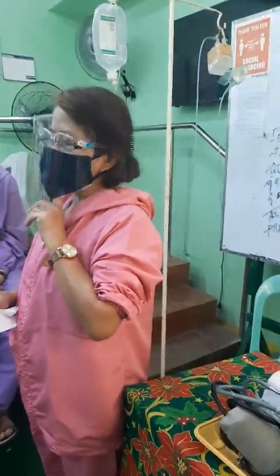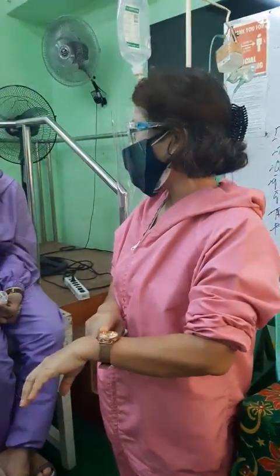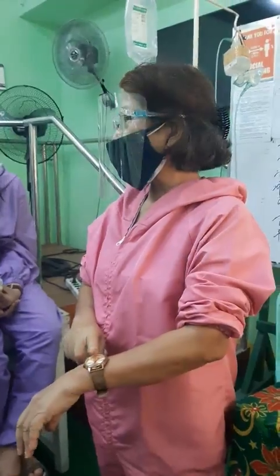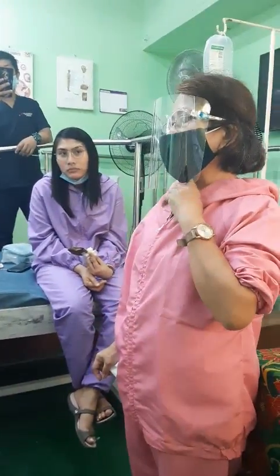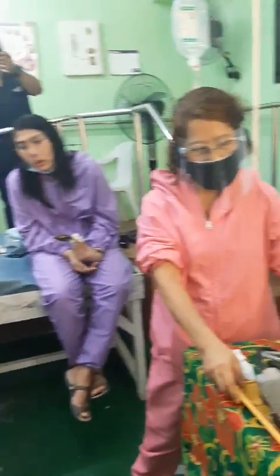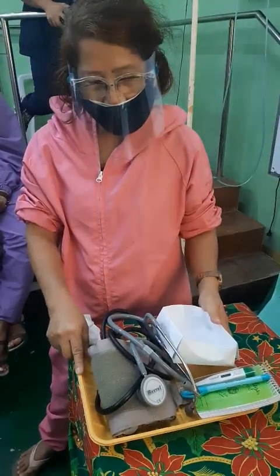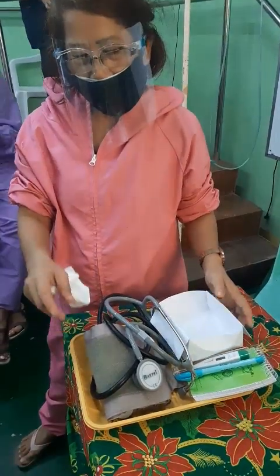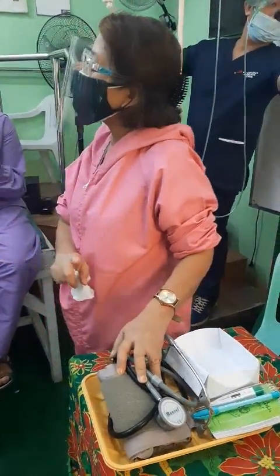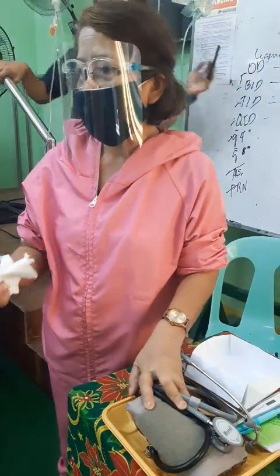When you get your vital signs taken, you should have a second-hand watch. If you go to the MC2, you will have to have your watch. Now I am facing my patient. The first thing I should do is organize all my materials — my vital signs tray. I should see to it that everything is prepared and organized. My BP apparatus is functional; I should have tested this before I take the vital signs of my patient.